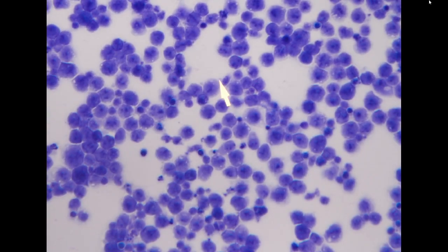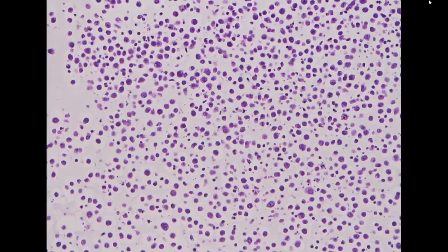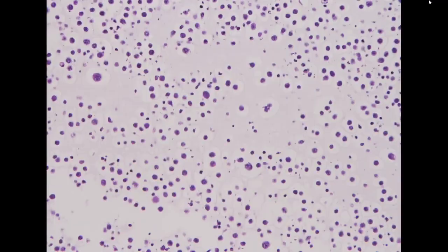Because in this specimen we have more cells, we have a nice cell block, so we will repeat the immunohistochemistry again in this specimen to save this for teaching purposes. So this can be saved for teaching in the future because it is not very common to see primary effusion lymphoma.